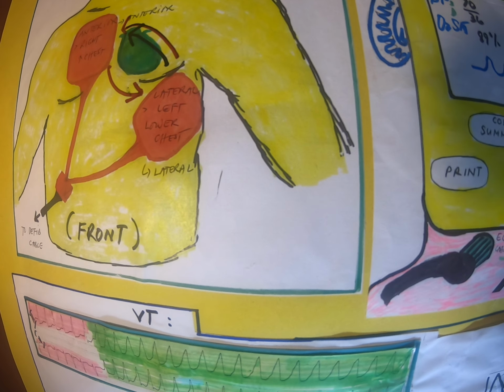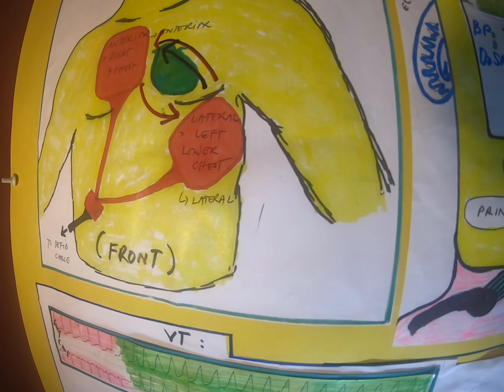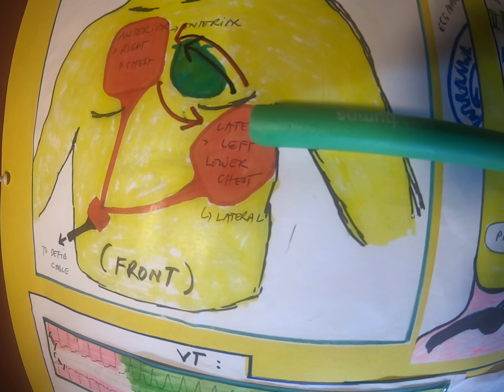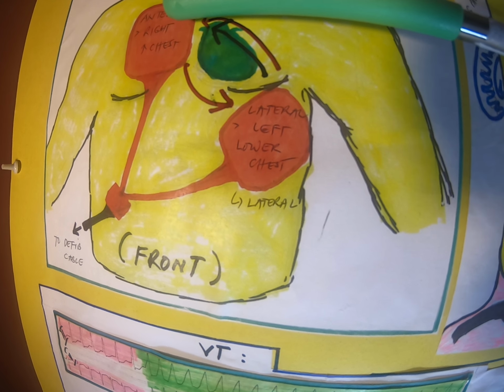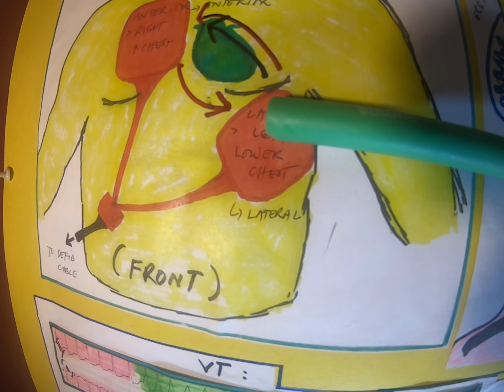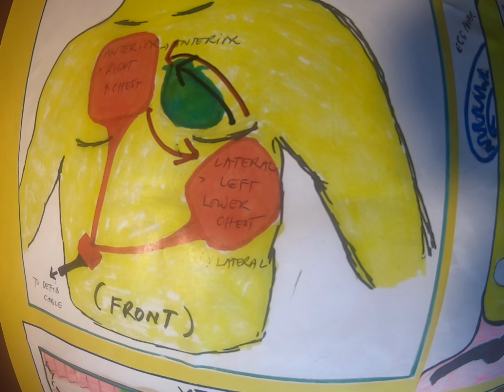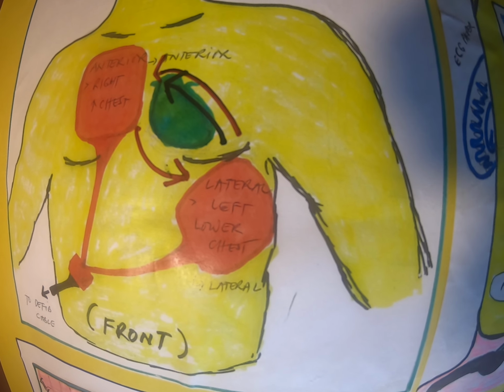If you use biphasic defibrillation, the flow of electricity goes in two directions. The flow is coming from here, lower pad to the higher pad. You see the arrow? And there is some electricity that travels from here down to the other pad. And it has more coverage of the heart muscle. But nowadays, most of our machines come as biphasic defibrillators.